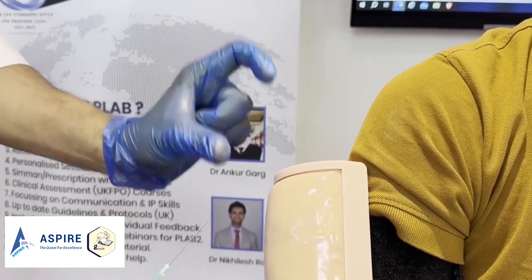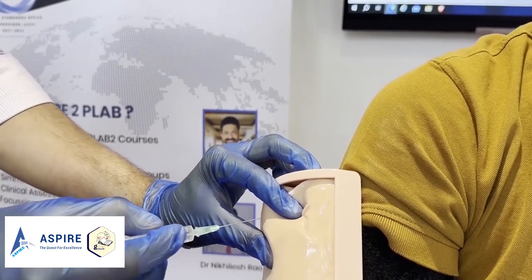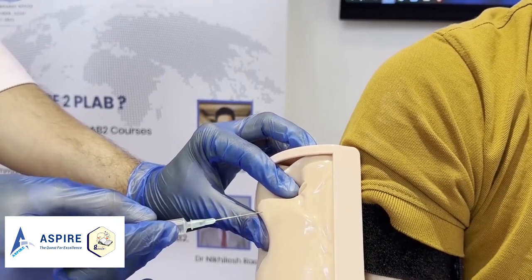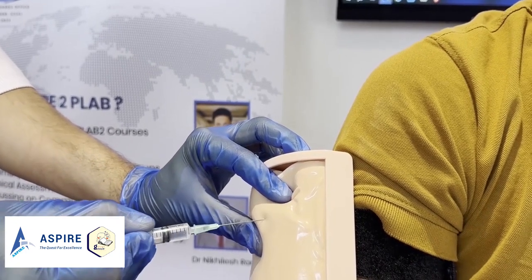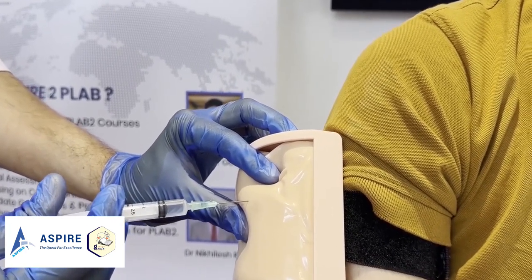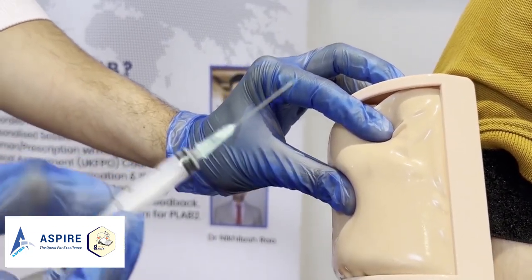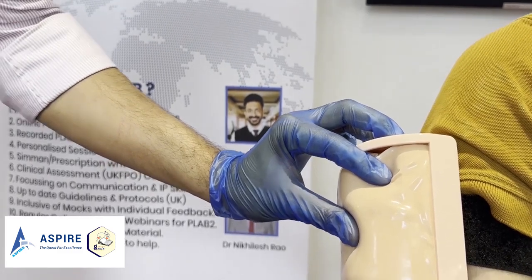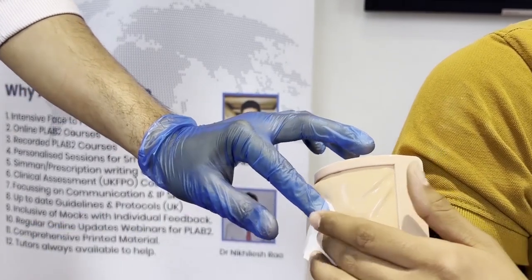With the thumb and index finger, pinch the skin where you want to inject, then go in at a 45 to 90 degree angle, making sure you are injecting into subcutaneous tissue only. You don't need to aspirate, as there are no major arteries or veins in the subcutaneous area. Inject the medicine, take it out, and dispose of it in the sharps bin. Give the gauze piece to your patient — 'Can you just hold it for me?' 'Yeah, thank you.'